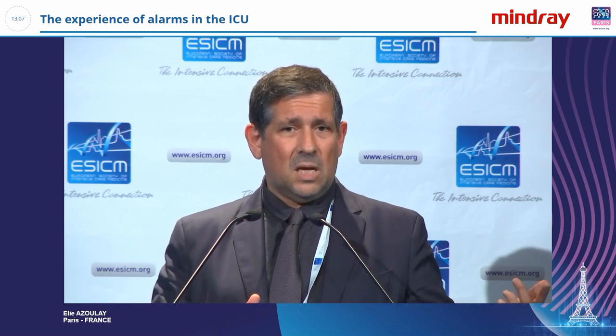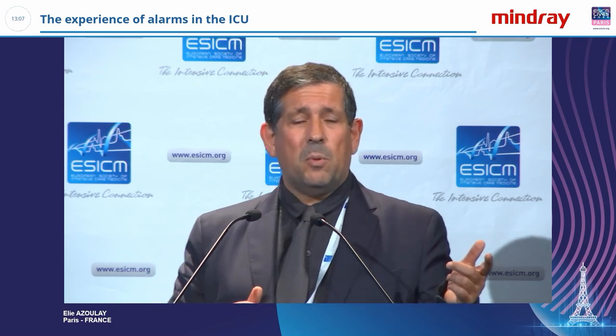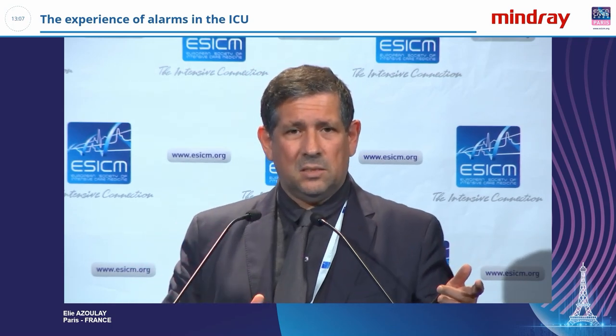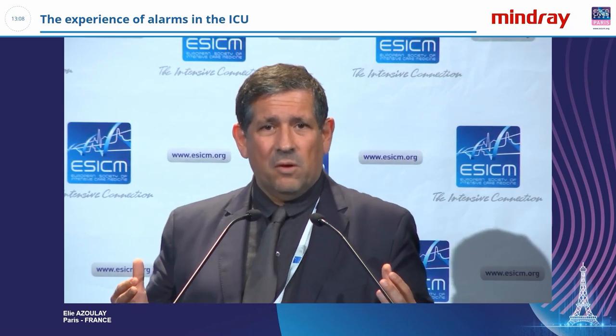The problem then is at a patient level and at a family level because they are questioning how safe your ICU is. On the other hand, if you are not adjusting the alarm at a unit level, you are not controlling alarm fatigue. You are maybe controlling your fatigue, but you are only one member of the ICU. You are not the ICU. So we need to find a systemic approach for that.